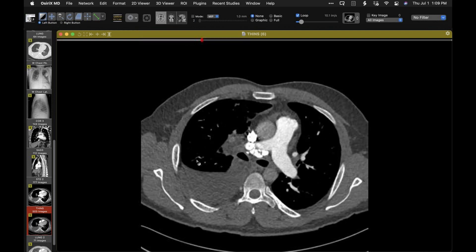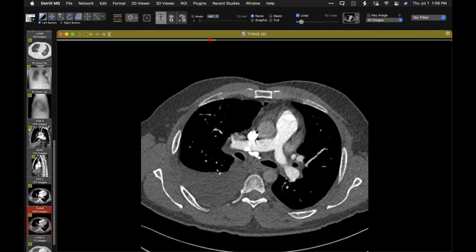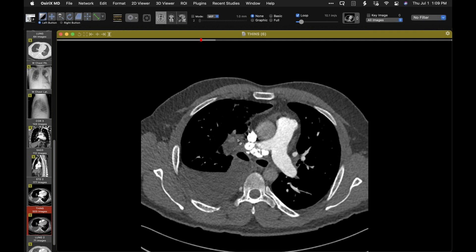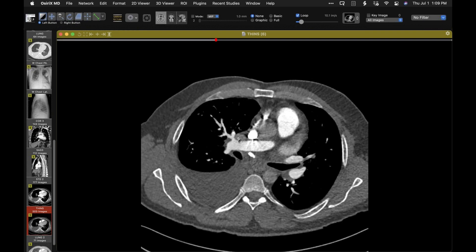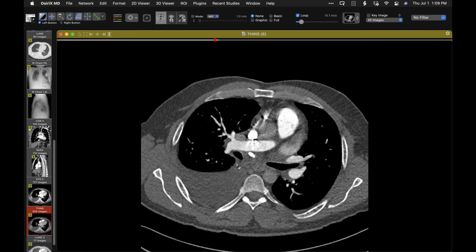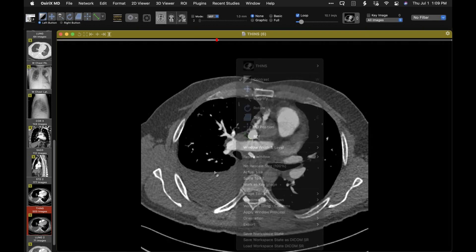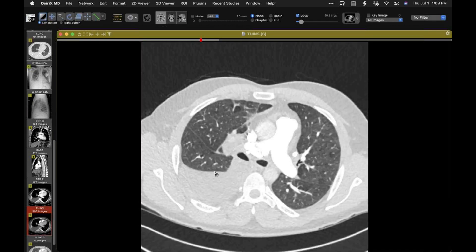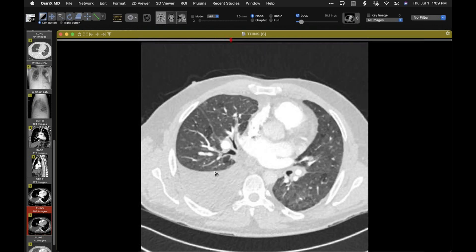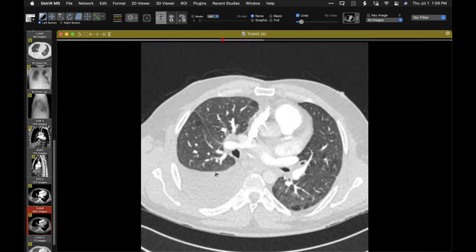Now this is 2019 as well, and let's look for that right superior pulmonary vein. We see a nicely opacified left superior pulmonary vein. We see the abnormal tissue in the right suprahilar region, and yes we can see some pulmonary vein here but it's not well opacified. This is a really nice example of granulomatous fibrosing mediastinitis or right suprahilitis clearly affecting the right superior pulmonary vein in particular, producing more right upper lobe pulmonary venous hypertension that influences lung edema — a nice explanation for the asymmetry and presumably for the chronic right pleural effusion.